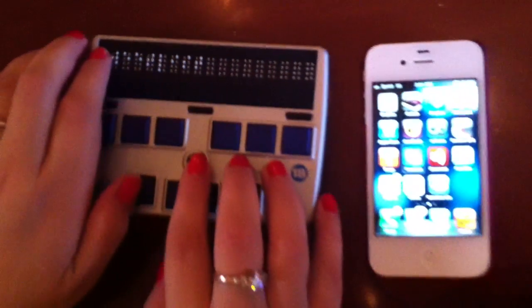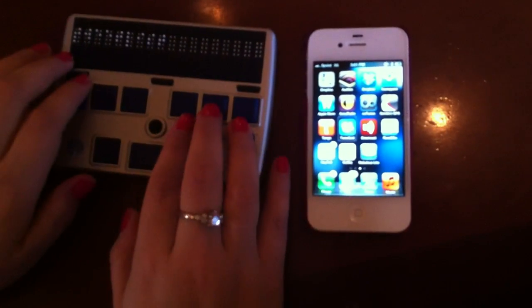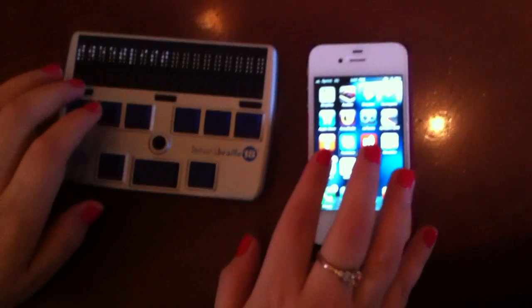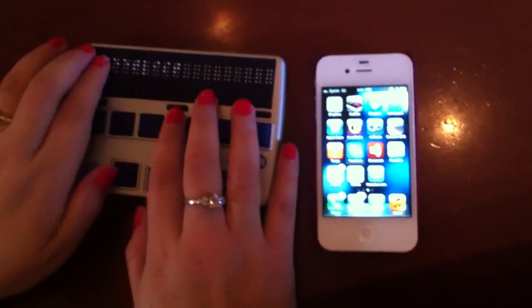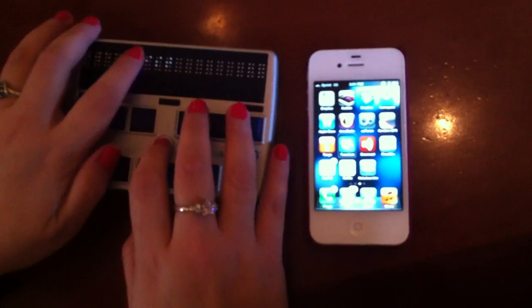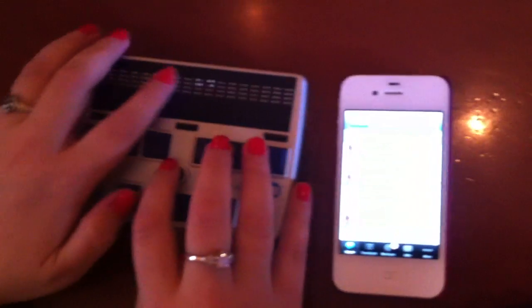So what I'm going to do here is I'm in Tweetlist right now, which is a Twitter app on the iPhone. Okay. And so my Braille display is connected to my iPhone via Bluetooth right now. Now, I don't see Tweetlist open on your iPhone, which is interesting. Now you do. There it is. It wasn't open yet. I was on my home screen. Okay. And no private tweets to be seen here, so. Oh, good. I hope not. Okay, it says Alley Talk.